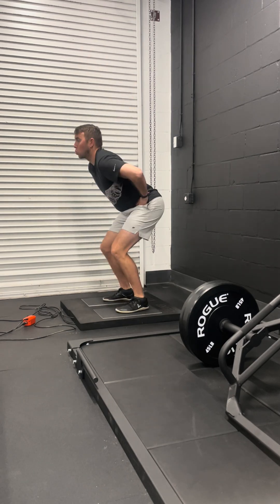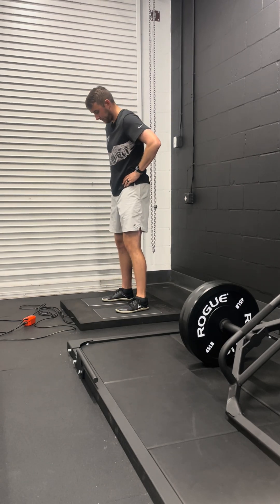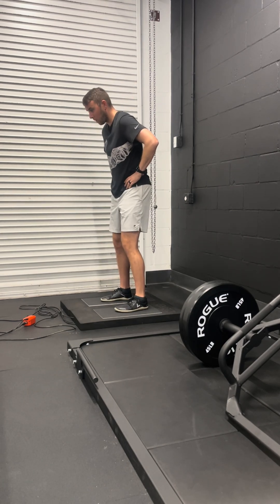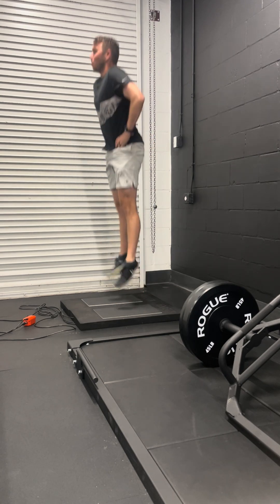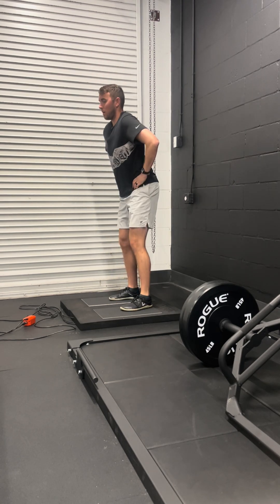Here we're going to be looking at counter-movement jump testing on our force plates. Whenever I take an athlete through this, I want to make sure there's standardization in the procedure that we use.